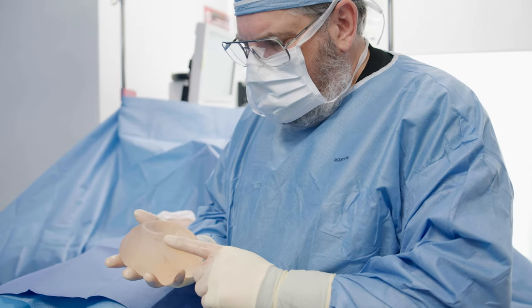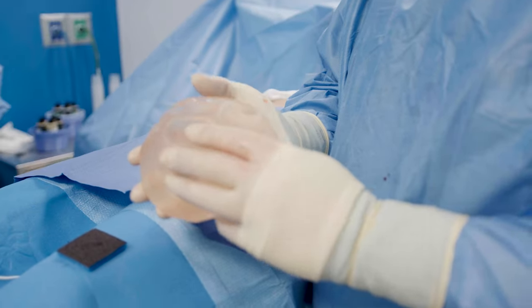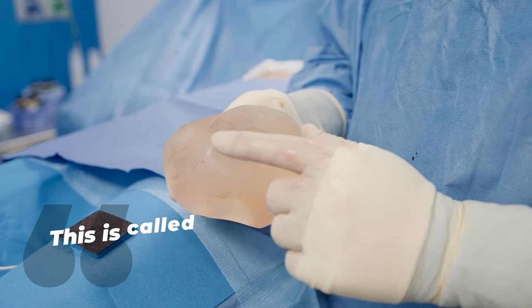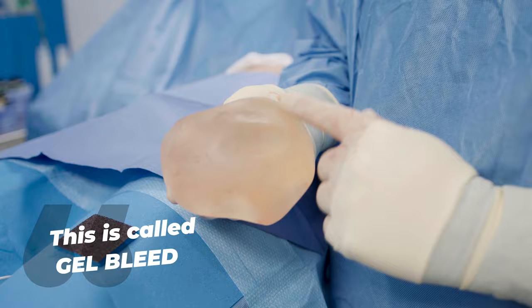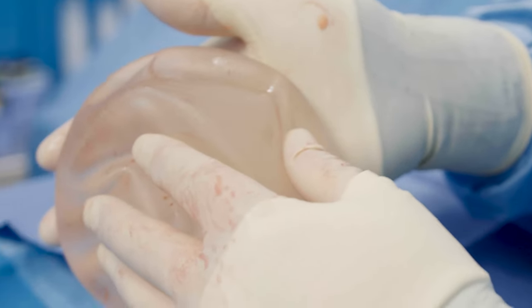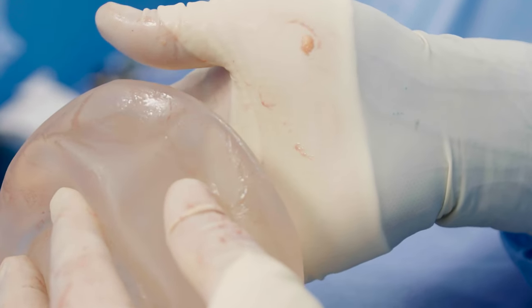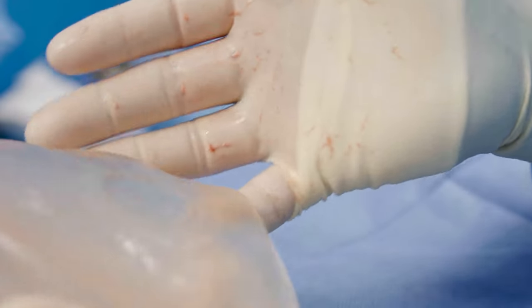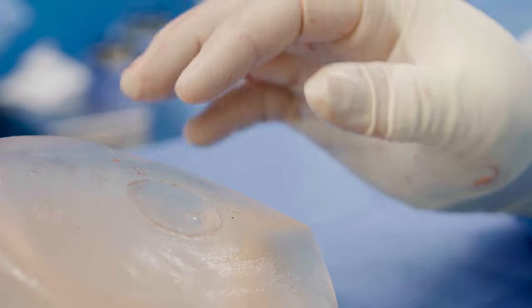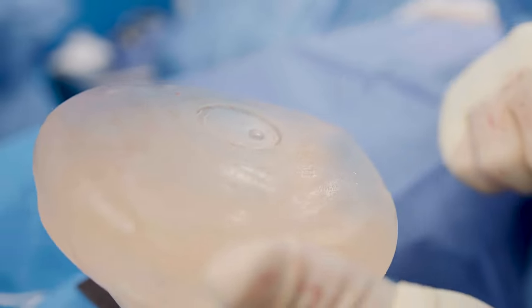This is something we don't see very much now with our newer Gummy Bear implants. But with this implant — this is a silicone implant — this is called gel bleed, where a little bit of the silicone comes through the implant. Can you see how it sticks to my hand a little bit here? So there's a little bit of silicone that's kind of leaking out of the implant — that's called gel bleed.